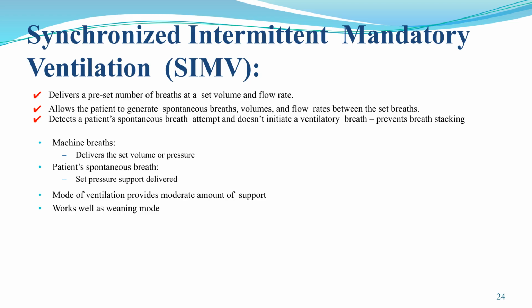Synchronized intermittent mandatory ventilation, or SIMV, delivers a preset number of breaths at a set volume and flow rate while allowing the patient to take spontaneous breaths in between. It is a moderate support and works well for weaning.